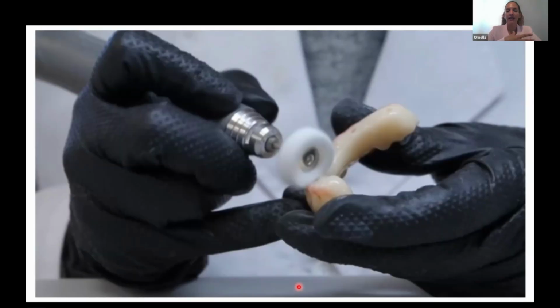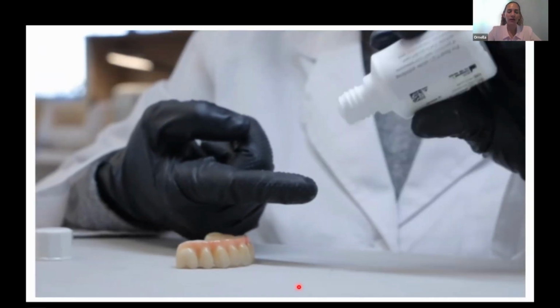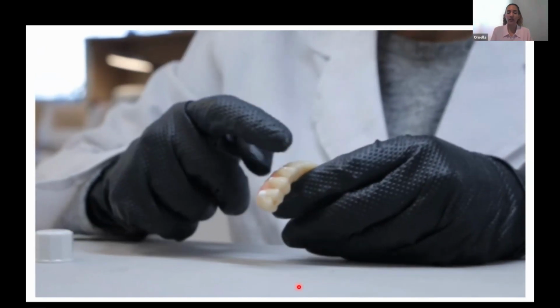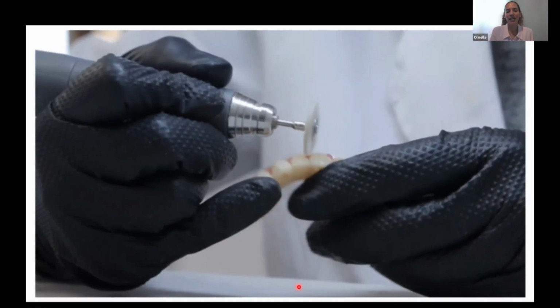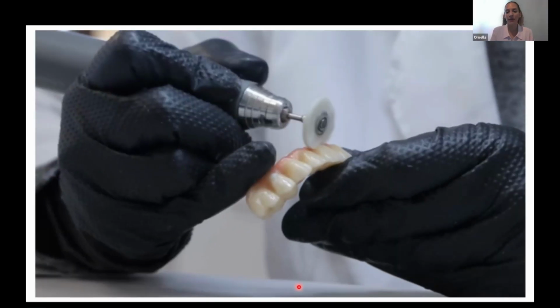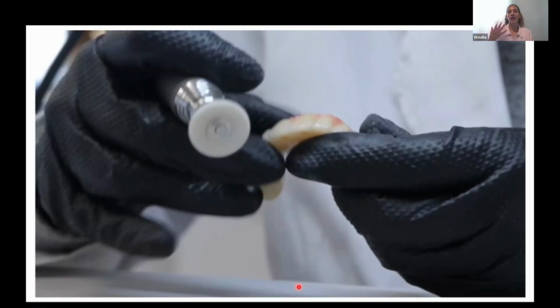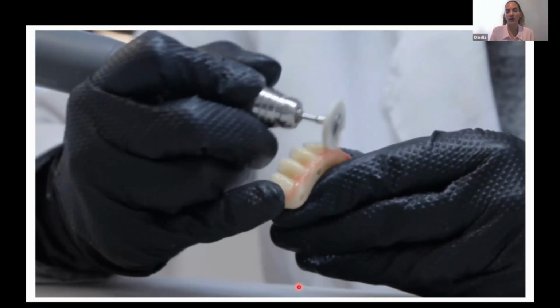I want the graphene material to be touching my soft tissue, okay, because of the physiological properties that are very, very good. So please, if you're going to do any characterization, do it only in the area that we can see, you know, in the vestibular. The rest, always try to do the polish because it's going to be better for our patient.